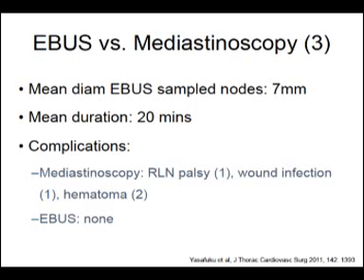So both procedures had low complications. There was one patient who had a recurrent laryngeal nerve palsy in the mediastinoscopy group. No complications were reported by EBUS. Next.